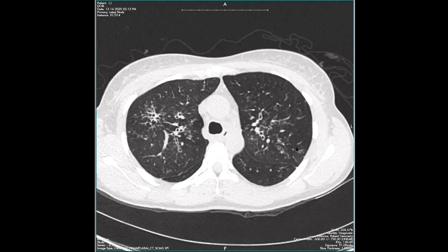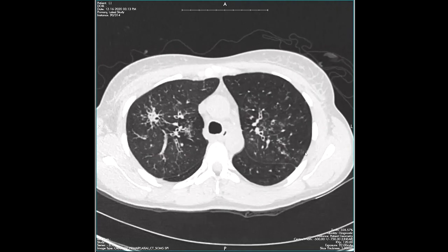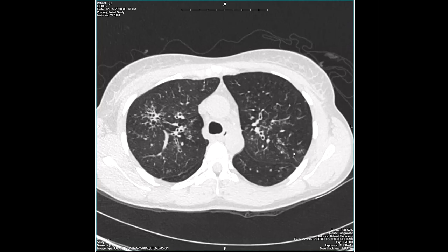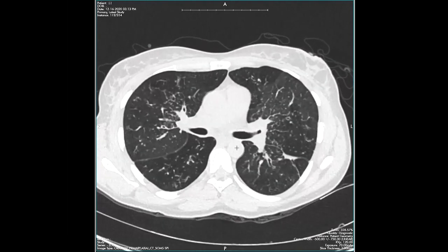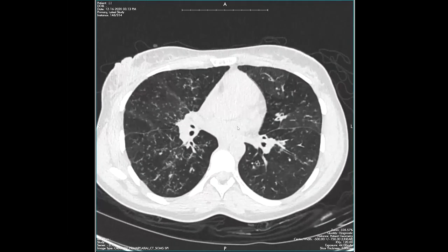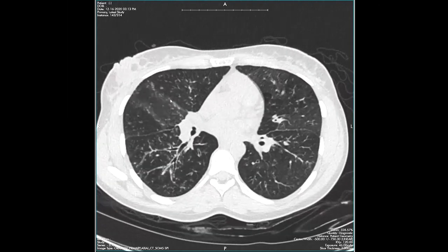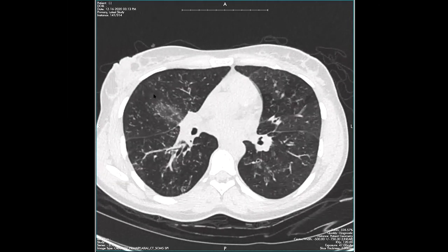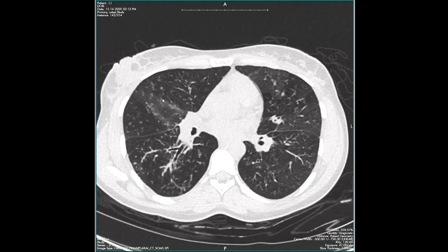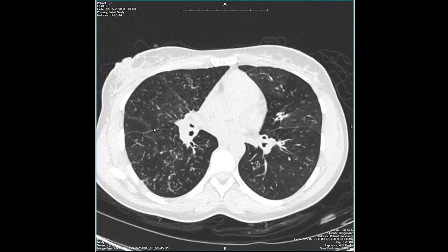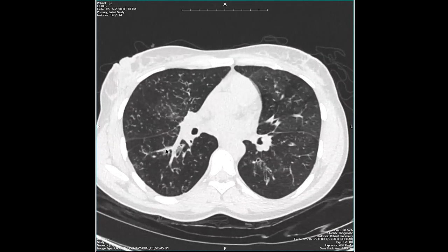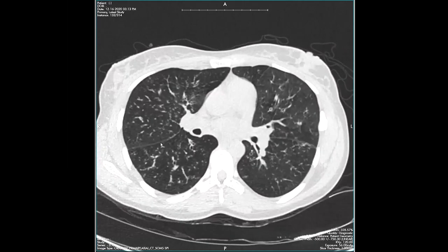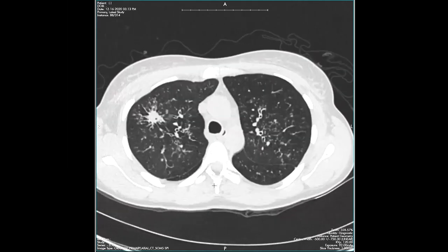You may be wondering, are these tree-in-bud opacities? That's totally reasonable. Based on this one area, I think I would have a really hard time knowing — am I looking at tree-in-bud opacities? But really the key thing with this case is to look for that fissural and pleural involvement. When we look at the fissures and pleural surfaces here, notice if we look at this minor fissure — look how many tiny dots are along this minor fissure, extending onto the major fissure. That is not good for centrilobular disease. So once you have involvement of the fissures, that tells you that you're probably not looking at a predominantly centrilobular finding.